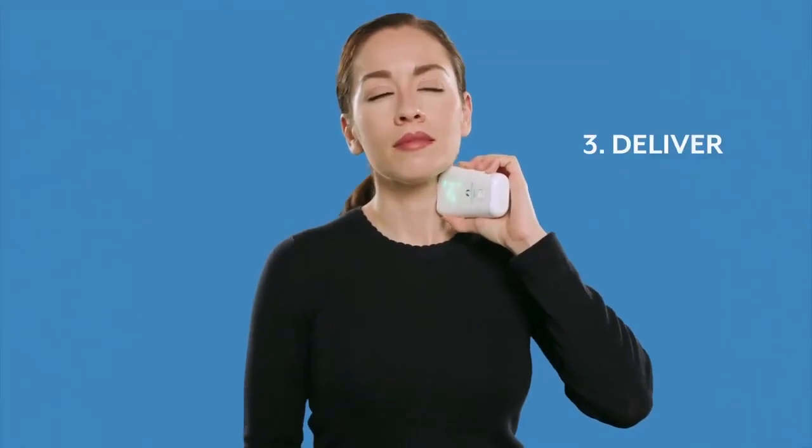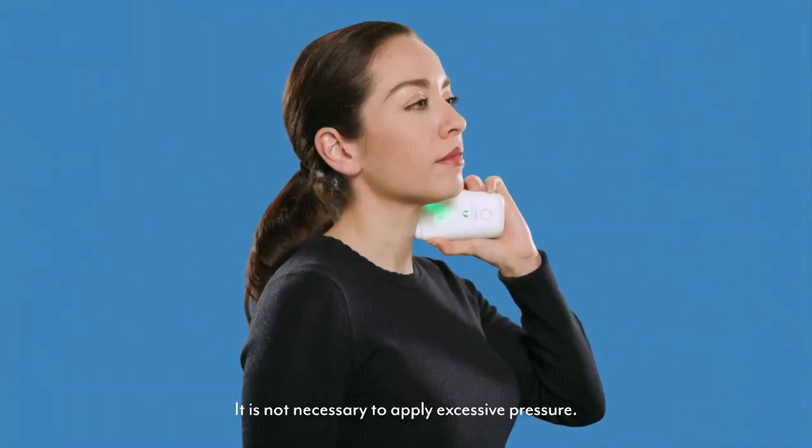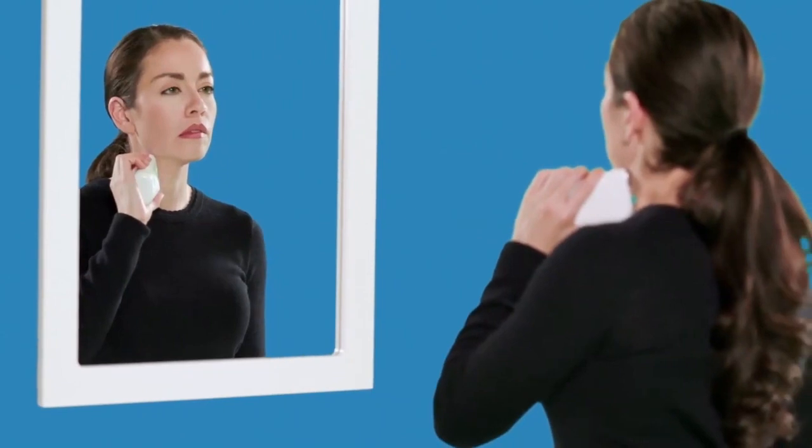Now you're ready to deliver the stimulation. Keeping the stimulation surfaces against your neck, increase the intensity by repeatedly pressing or holding down the top of the control button. You should start to feel a deep and strong vibration inside your neck. Continue to increase the intensity level until you feel some slight muscle contractions. The most common muscle contraction is a downward pulling on your lip at the corner of your mouth. Not everyone feels this lip pull, but you will likely feel some type of muscle contraction below your lip. These muscle contractions and the associated lip pull indicate that GammaCore is positioned correctly and that you have likely reached an adequate intensity level.